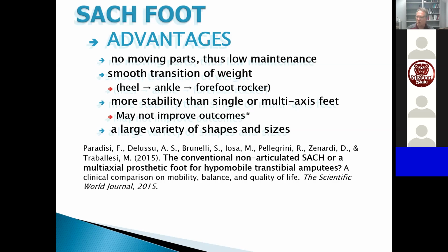Then the same patients using this SACH foot. So again, the question I want you to think about now is patients walked better, walked faster, and with less energy use using a prosthetic foot that could plantar flex compared to a SACH foot, which was surprising for a lot of people because we always thought that the SACH foot was best for these debilitated and older types of patients. So what is the foot that is permitting plantar flexion doing better than a SACH foot is doing?